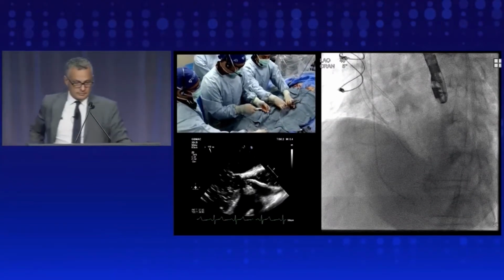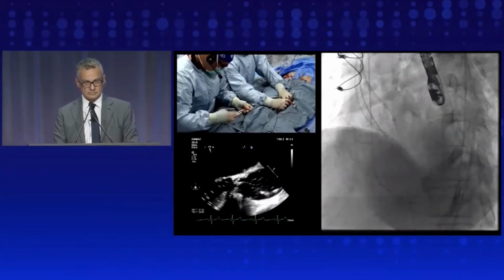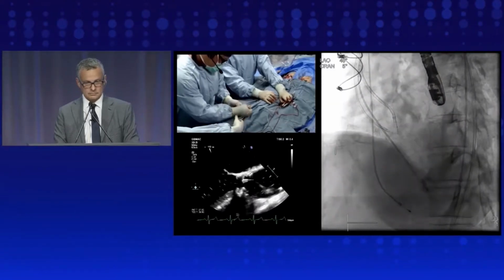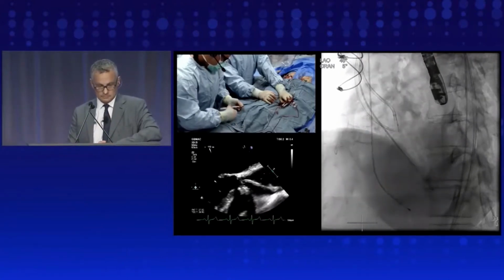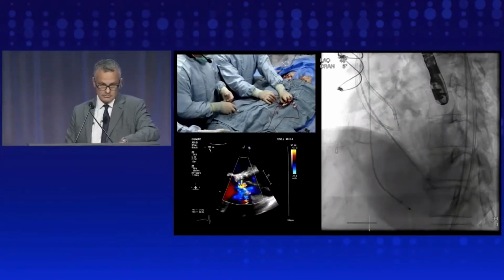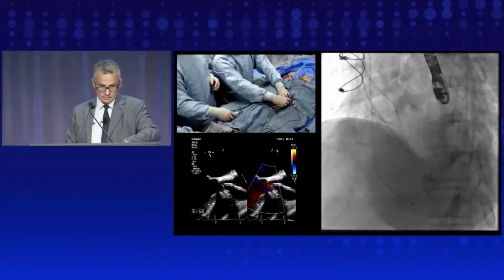All right, thanks, Francesco. So at this point, we're about to do the laceration of the left. We're all set up. So what we see, I'll do cine for a second, and there is a pigtail in the LV coming from the big sheath. We have an 8 French AL4, and we have a multi-purpose 6 French. Having the different sizes is helpful just to differentiate. Yes, correct. And there is a Astato wire between them, and you see a dot there. The dot is the end of the piggyback micro catheter.